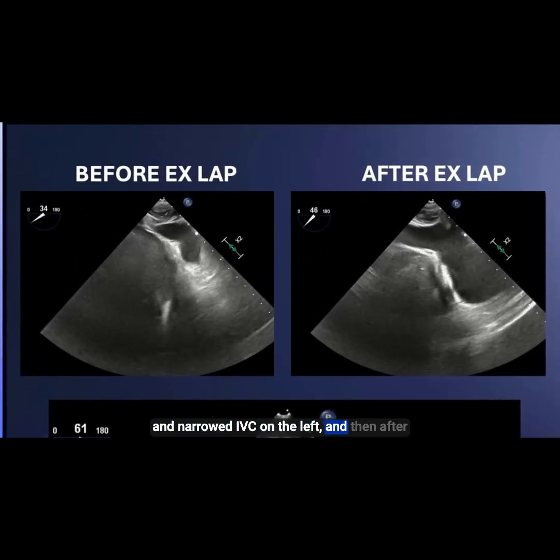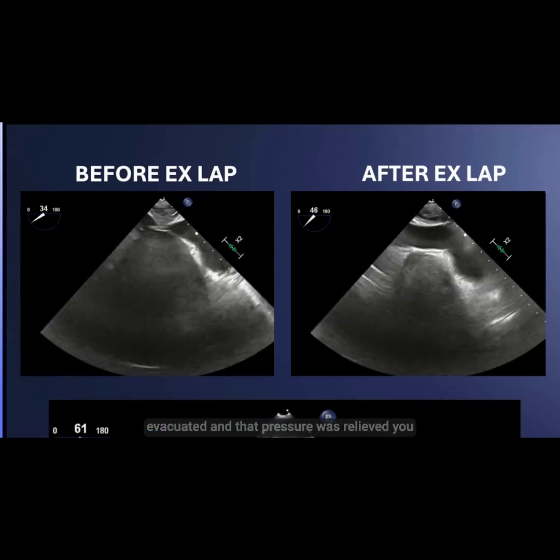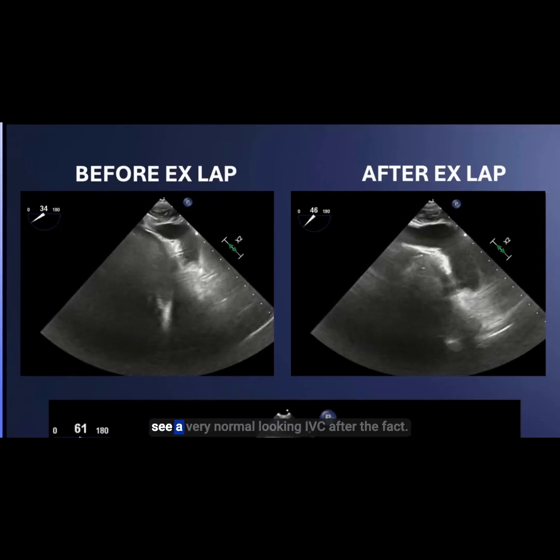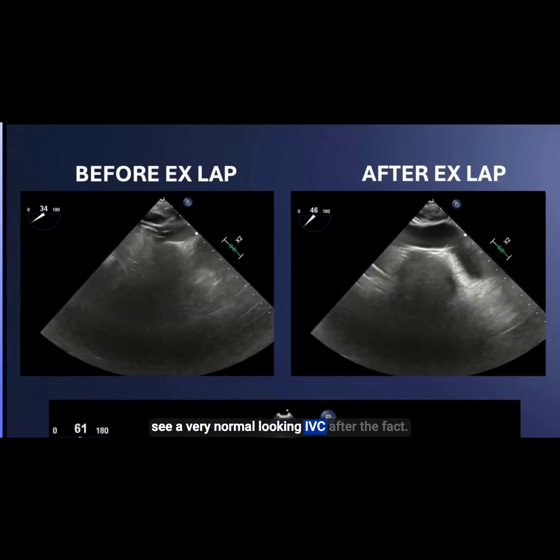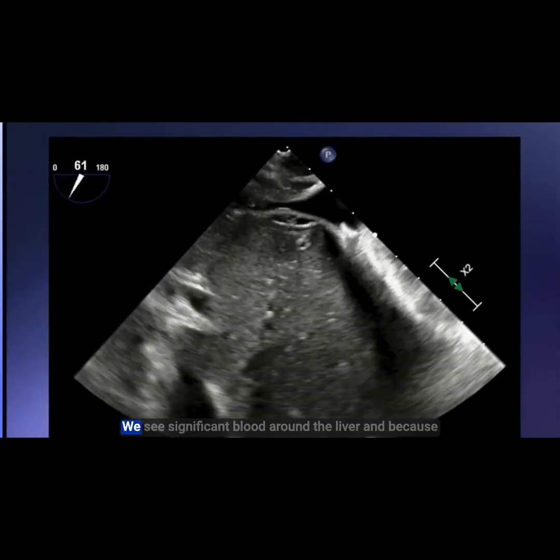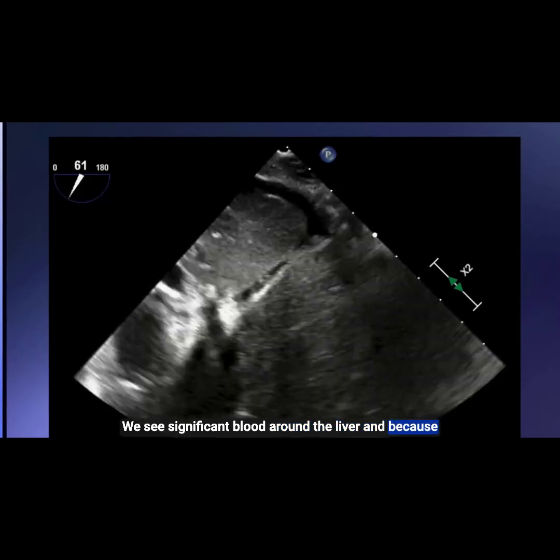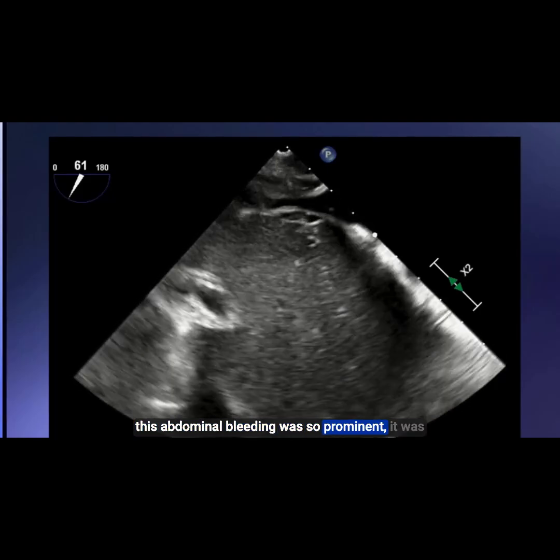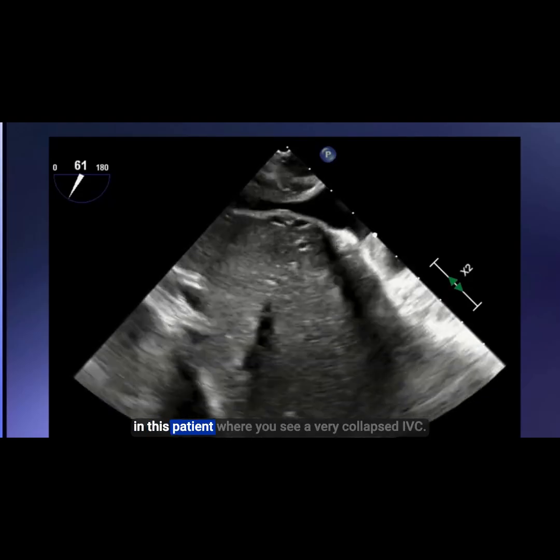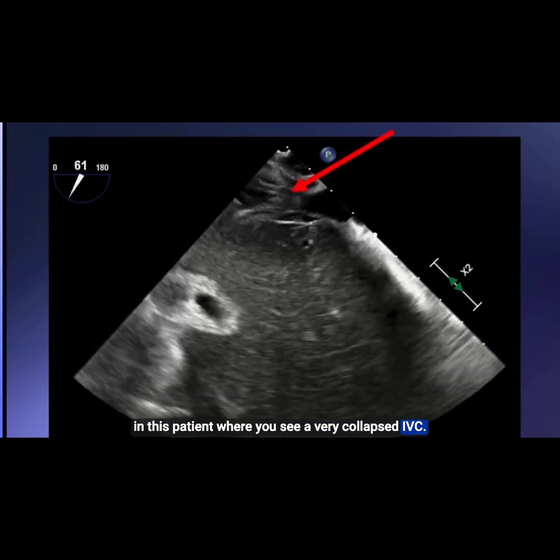Here's a case of a patient who had a compressed and narrowed IVC on the left. After an ex-lap was performed, blood was evacuated, and that pressure was relieved, you see a very normal looking IVC after the fact. In another patient, we see significant blood around the liver, and because this abdominal bleeding was so prominent, it was also causing abdominal compartment syndrome, where you see a very collapsed IVC.